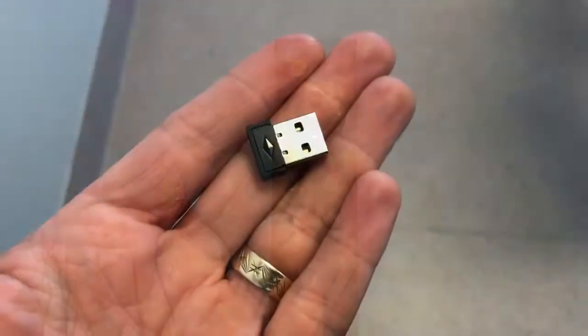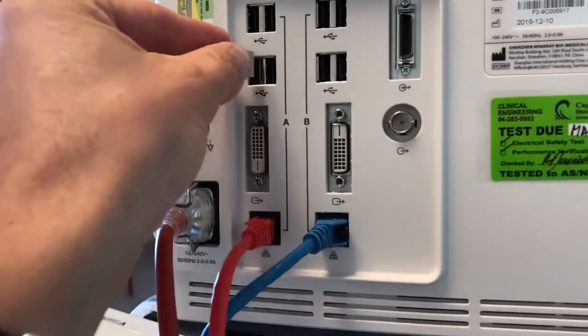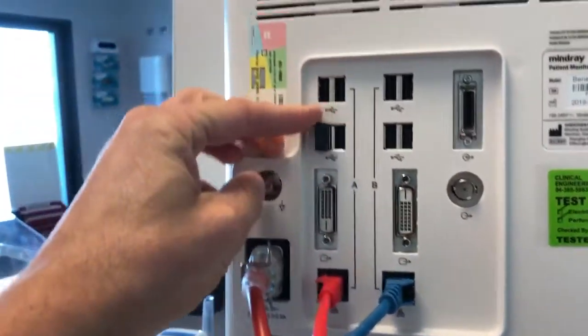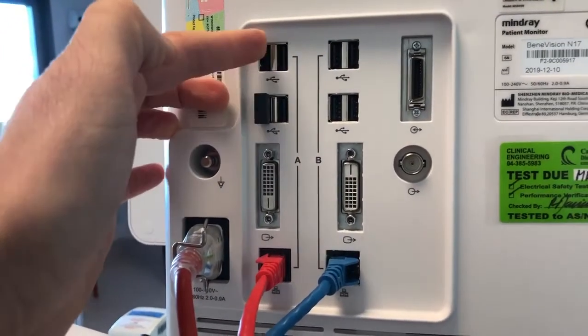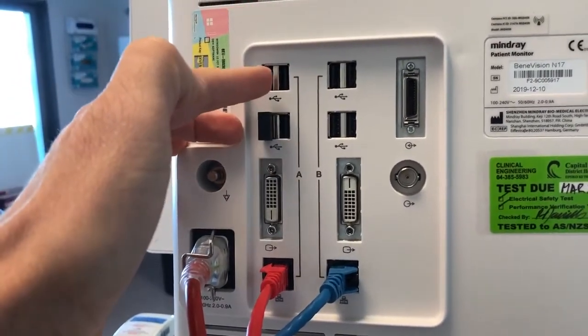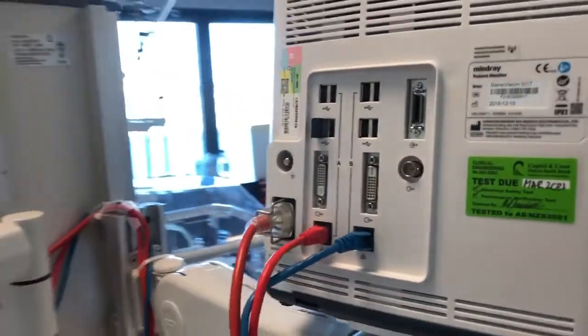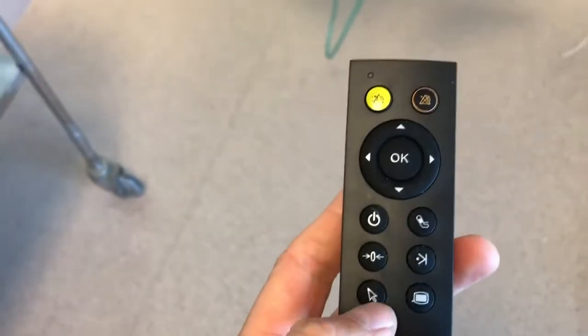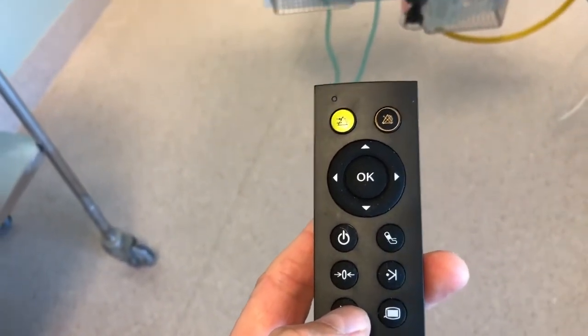So here we are setting up in the bed space. The first thing I'm going to do is grab the USB dongle and pop it into the back of the monitor — in this case I'm going to use the left-hand side USB connection point. It does matter which one you use; on this monitor, the N17, we've got four available. If you're not sure, just check in with your Connected Healthcare representative. On the handpiece, the first thing is to push the mouse click button, which wakes up the mouse function — one of the most useful parts of the remote control.